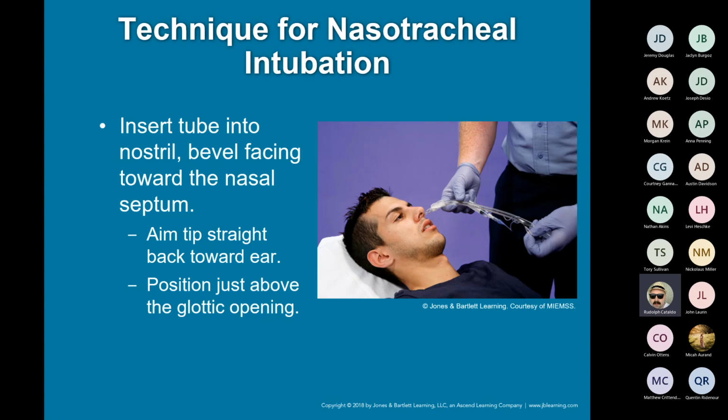Now, you generally want, I wouldn't say back toward the ear. It's almost like a down and towards the ear when you're inserting this, because at that point, it's going to be a lot easier to advance. Kind of like if you put a nasal in and sometimes it's a little bit harder than normal. It's not because they have a really constricted nasal opening or nasal passage. It could be it was inserted wrong in the beginning. So usually you just swap to the other side.